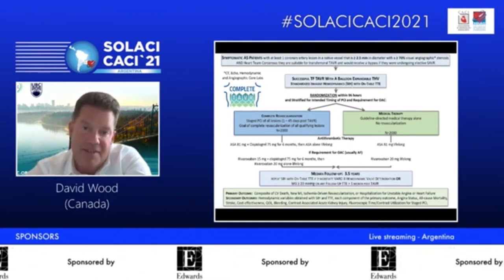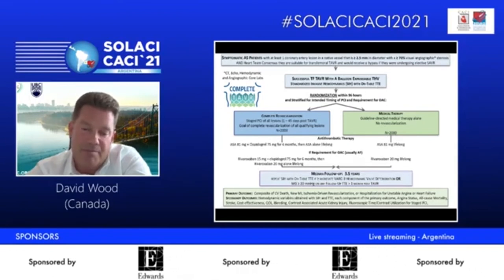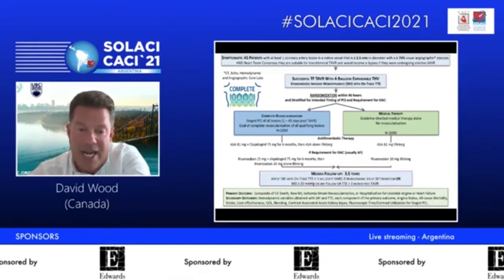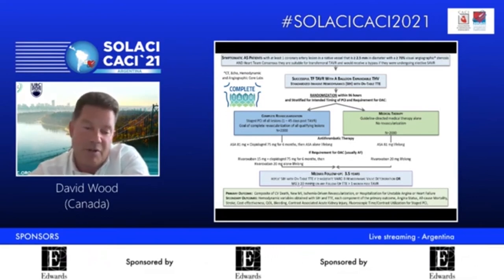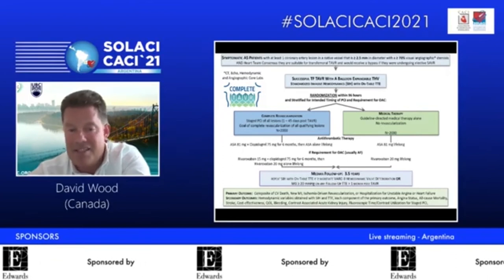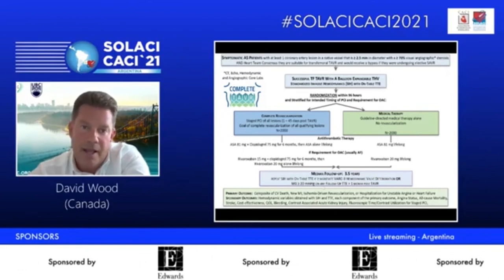And then here's the key part. All 4,000 have standardized invasive hemodynamics with an on-table echo at the beginning. And if at any time during the median 3.5 year follow-up, maximum 5 year, they have elevated gradients or meet moderate VARC-3 hemodynamic valve deterioration, they come back for a repeat assessment. So we're going to be able to tie this to hard clinical outcomes: death, MI, ischemia-driven revasc, rehospitalization.